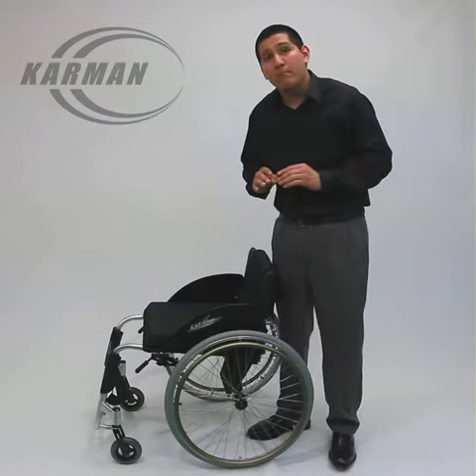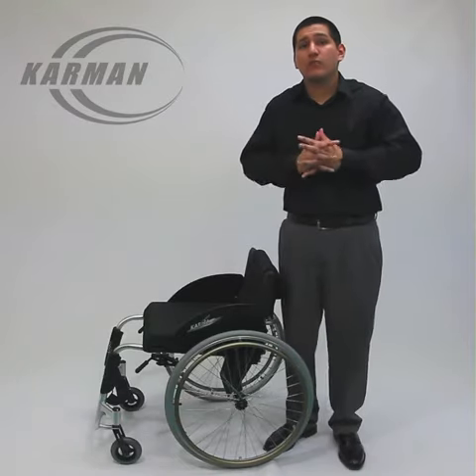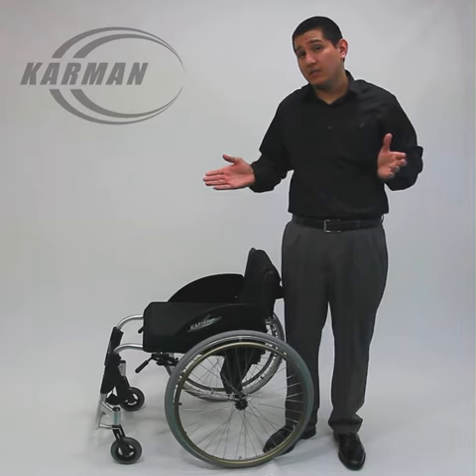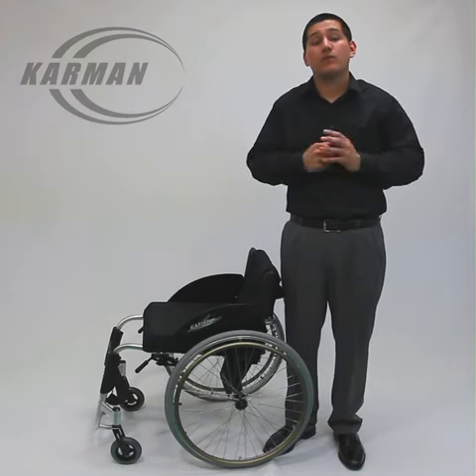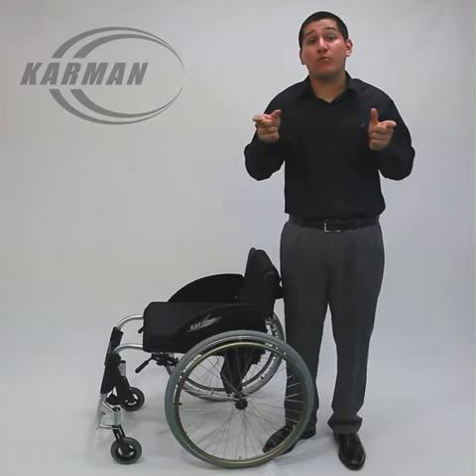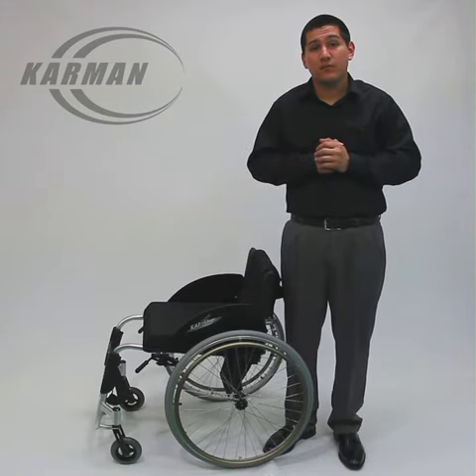This chair would be a much more suitable chair for someone who is looking to be very active, roll around by themselves, and go out and live an independent life. For more questions and product videos, please visit our website and look for a brand new model coming soon. Thank you.